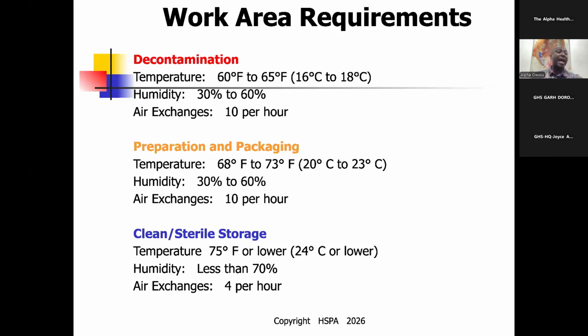And these are guidelines. Nana, please. I want some clarifications. This is Nanaya from Eastern Regional Hospital, Koforidua. With the air exchanges, are we talking of the 10 per hour? Is it the molecules or the speed? Yes, the molecules. This is how it is tested.